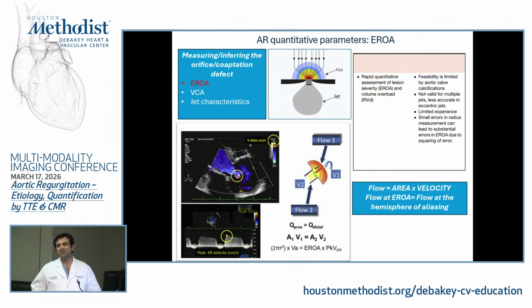Yes. I can tell you're starting on those echo boards. So this is sampling theory, and it's also not an echo concept, but it's applied to echo. When you have color Doppler and by extension pulse wave Doppler, both are the same thing. You have a limit as to what velocities you can display.